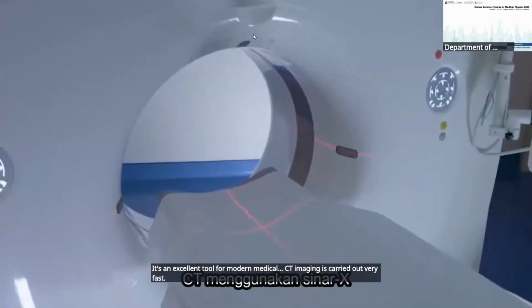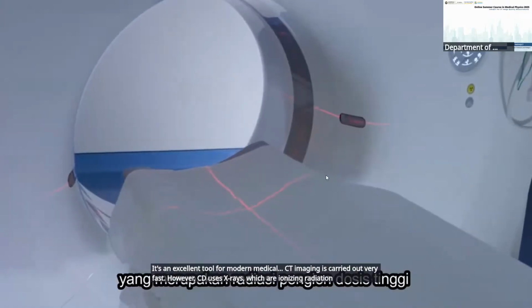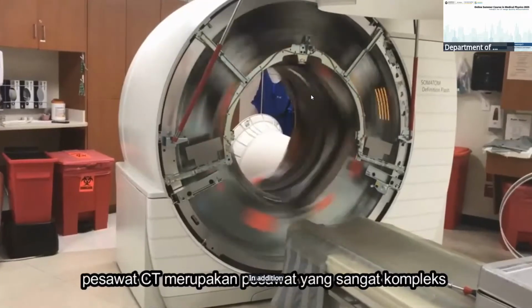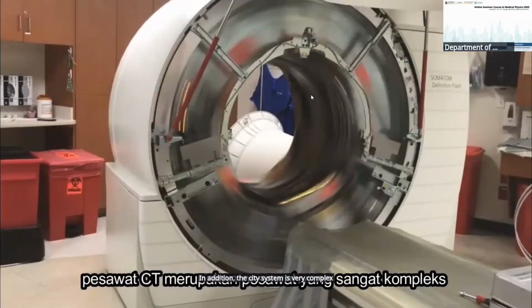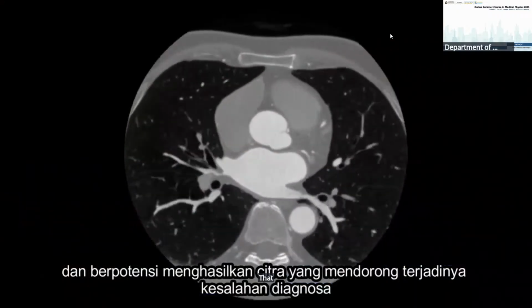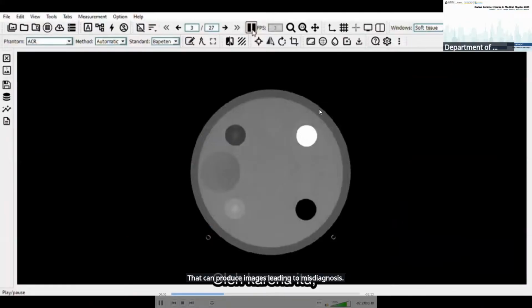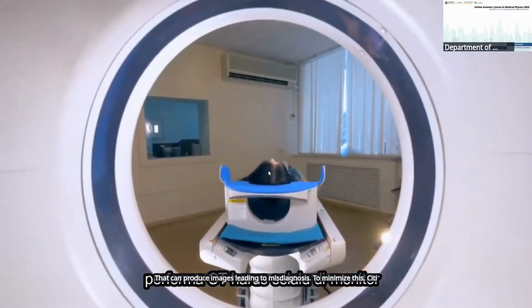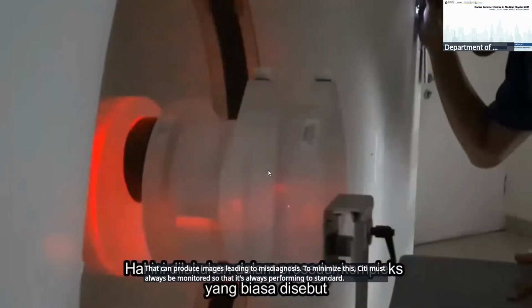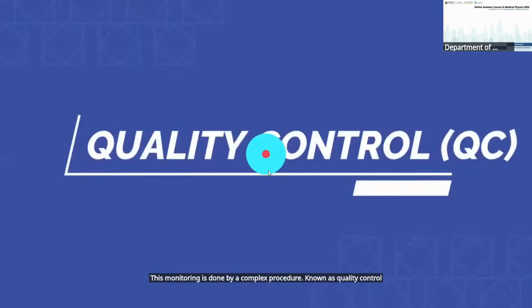However, CT uses X-rays, which are ionizing radiation, so its use can cause harm to the human body. In addition, the CT system is very complex, so there are potential errors from each stage that can produce images leading to misdiagnosis. To minimize this, CT must always be monitored so that it's always performing to standard. This monitoring is done by a complex procedure known as quality control or QC.